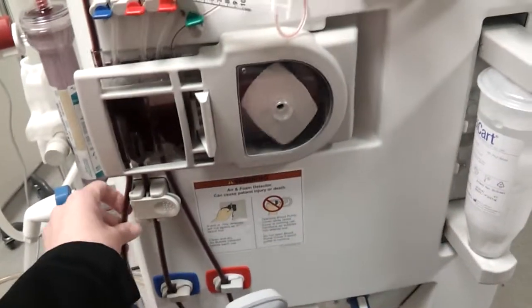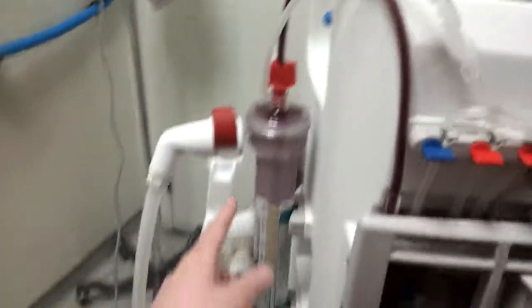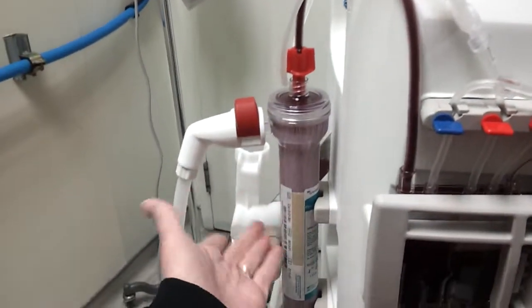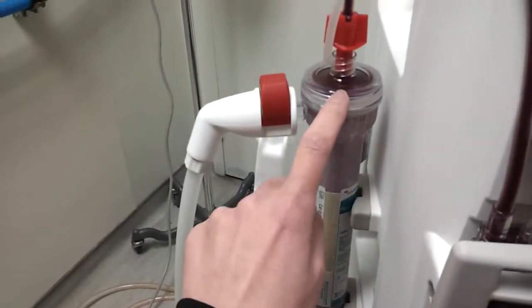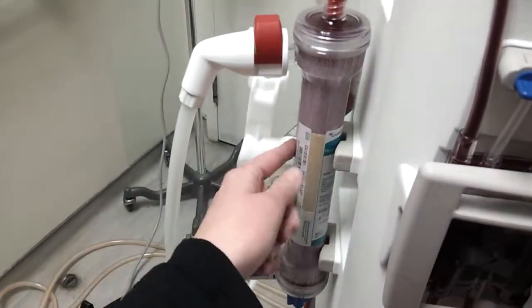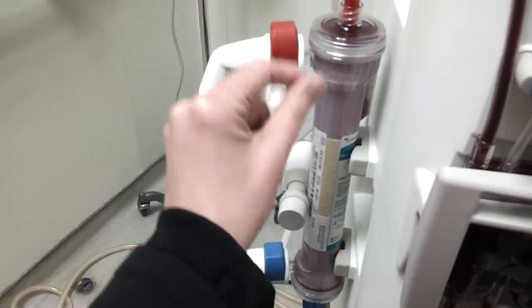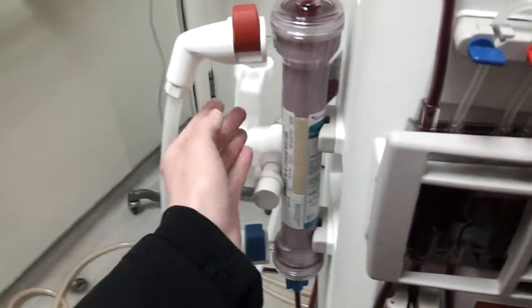So when it gets pumped into the machine here, it goes through the chambers into this, our actual kidney. This is my artificial kidney. And it actually works just like a normal kidney would, except it's obviously not attached to your body. If you look closely, you can see there's all kinds of little fibers in here. And these fibers actually help filter out any toxins that are in your bloodstream, just like your kidney would, because your kidney actually has little tiny microfibers inside of it. Obviously, they're not artificial, but God meant them to be there.